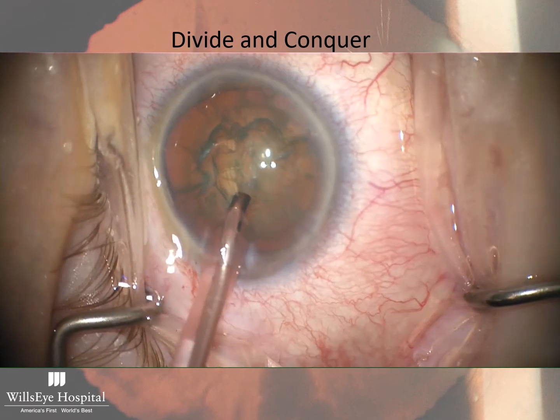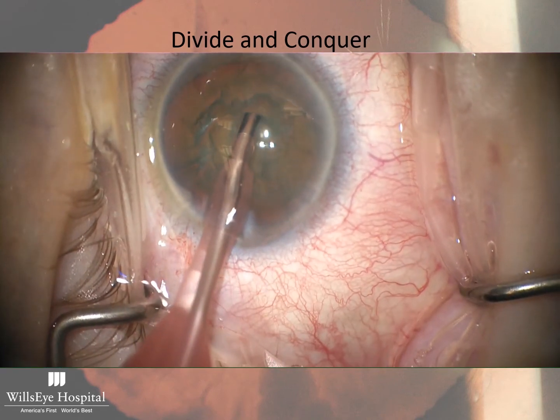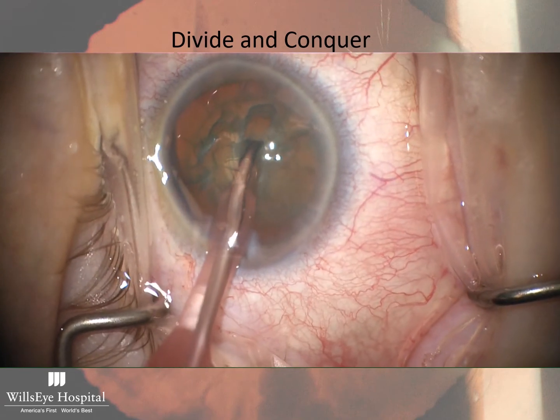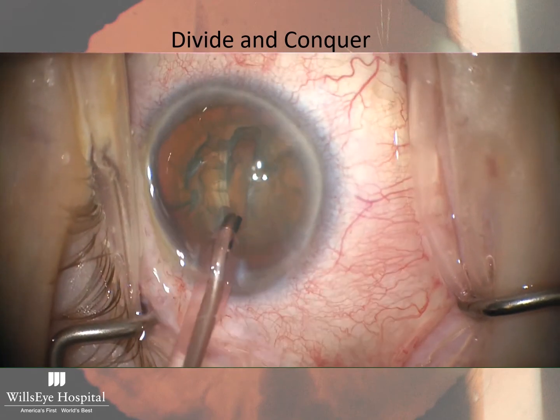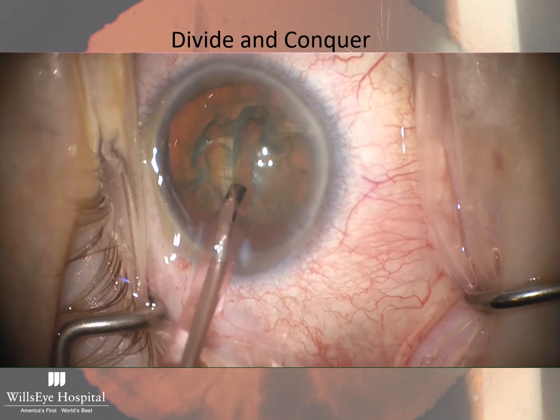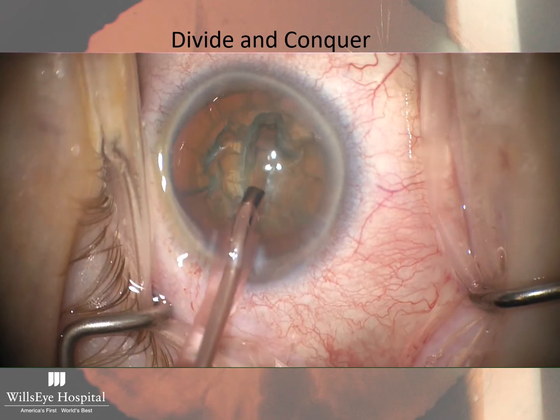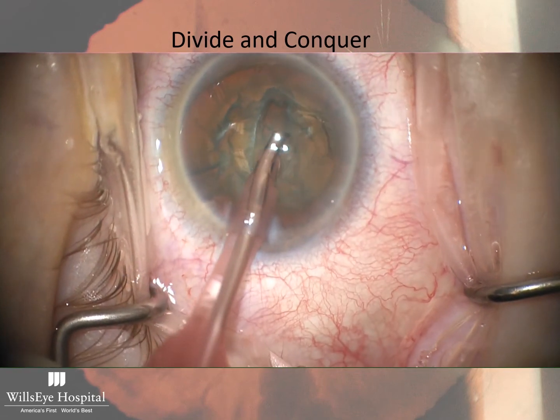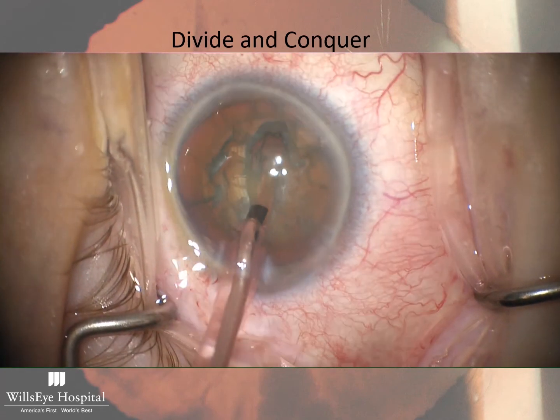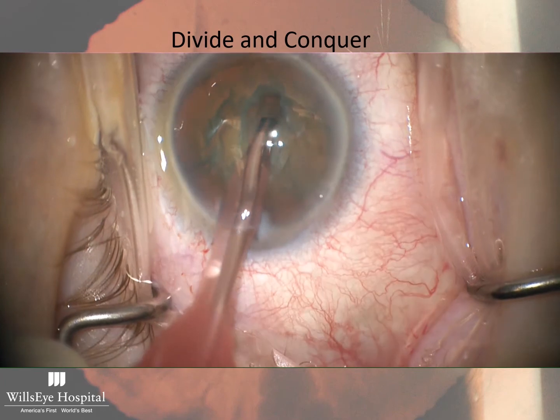So here, starting my groove, you can see that it's cutting nicely through the lens. If you're having difficulty and not going through the lens, you need to increase your torsional power on the phaco unit. I'm taking partial thickness bites, and as I get further down, I do widen the initial anterior edge of the groove in order to allow for the sleeve.